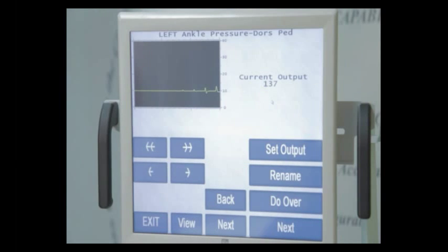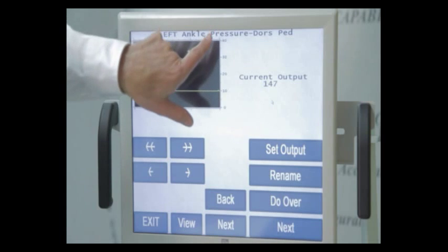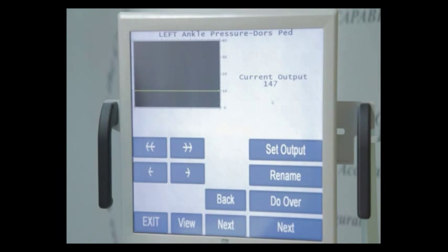There's 4 right there, so we're going to scroll back to that first small blip. Then after we finish lining it up and looking at the pressure of 147, we see, oh, left ankle dorsalis pedis. When you got distracted, you put your probe on the posterior tibial artery. Well, it's a good pressure, it's just at the wrong place.